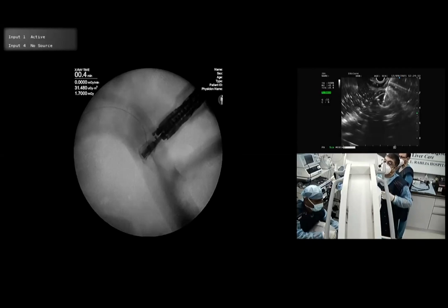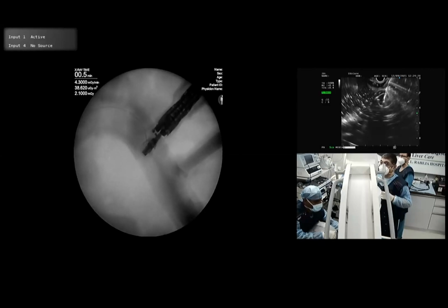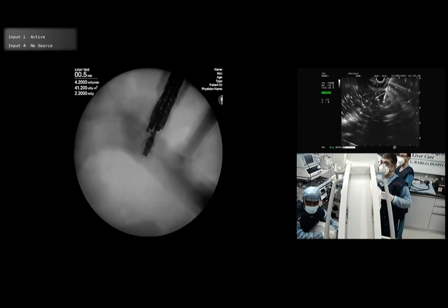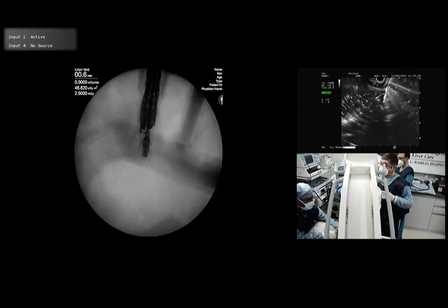Take the scope to 12 o'clock. Turn it a little. No, other way. Or. Yeah. You can see a part of the sheared wire where I have punctured.